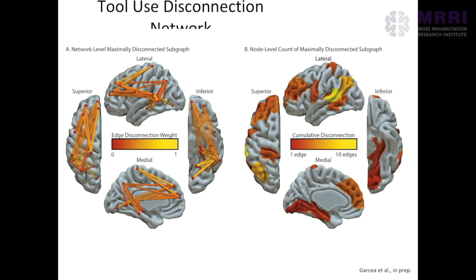The output of the analysis, once you do the SVR, is beta weights, feature weights for each edge, a vector of feature weights. You then bring that back into 64 by 64, much like how you get a whole brain map of raw beta weights from your voxel lesion symptom mapping. Then you just do more permutation testing like we do with these other approaches. So it's the same pipeline.